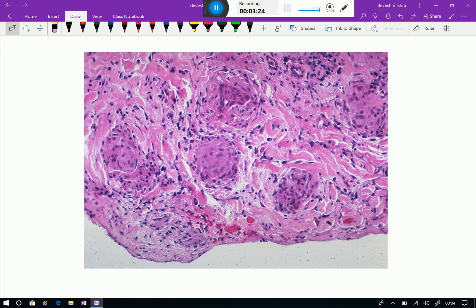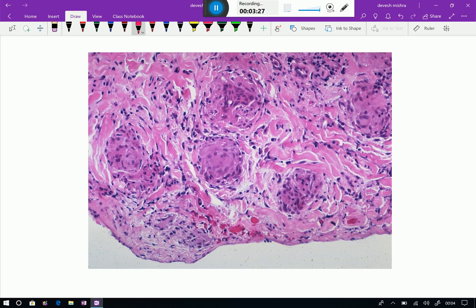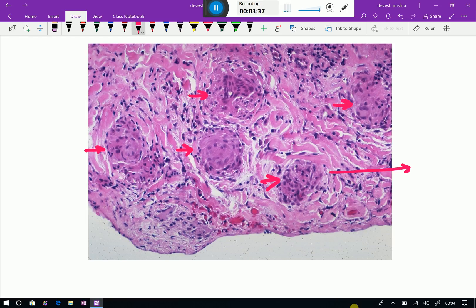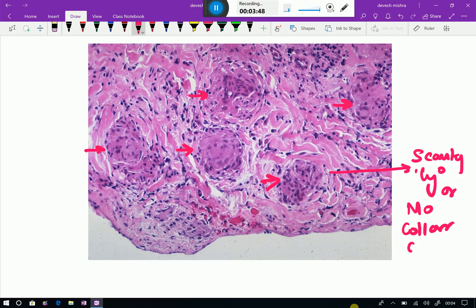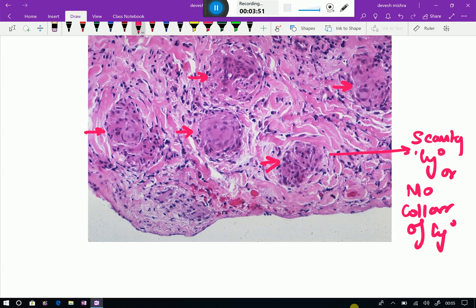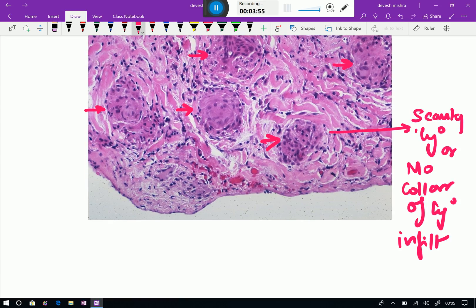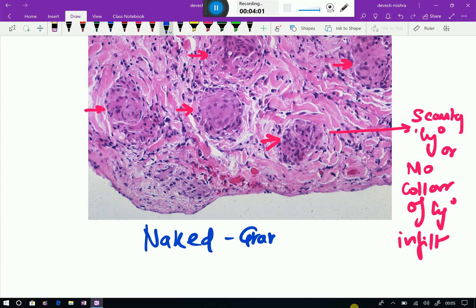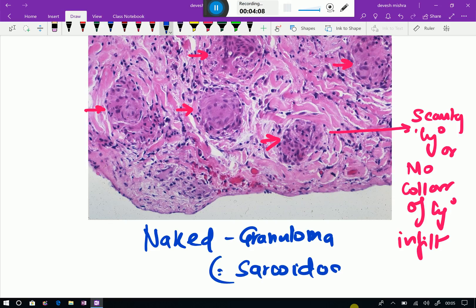Now I will show you a special kind of granuloma. You can see here these are all granulomatous foci — all these are granulomas. If you observe, in all these granulomas there is no lymphocytic infiltrate, or scanty lymphocytic infiltrate — no collar of lymphocytic infiltrate. This is an example of naked granuloma, which you see in sarcoidosis.